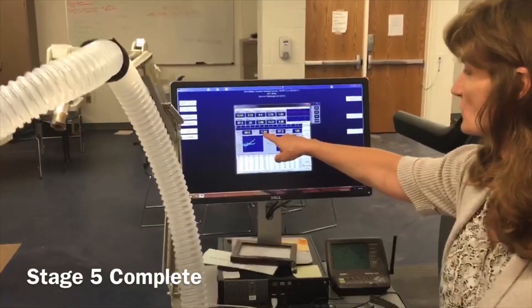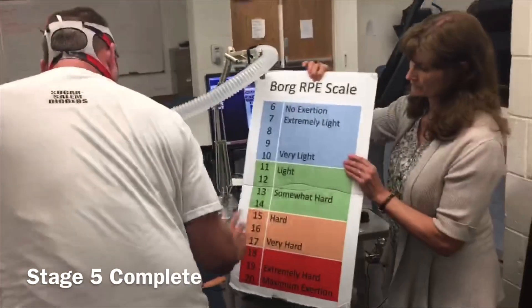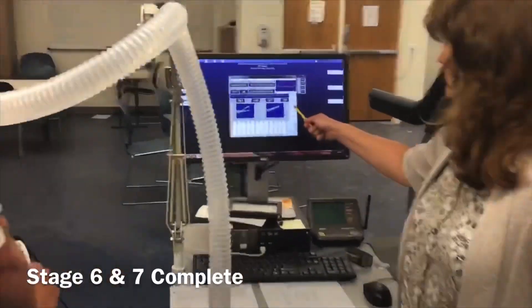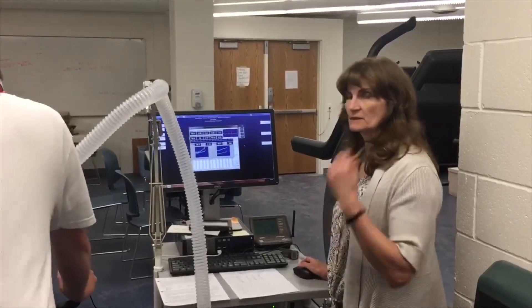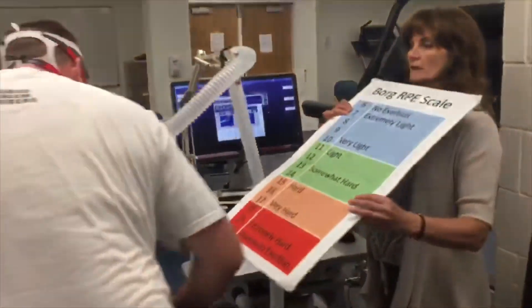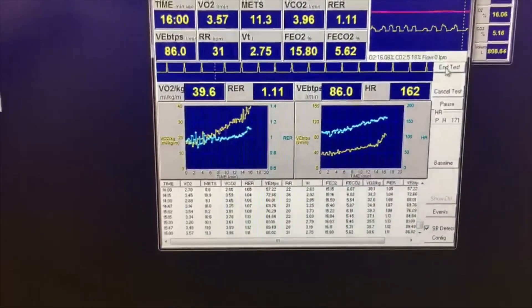Now our RER is up to 1.03, and heart rate is about 154. The RPE value at this level is 15. The subject tells us he's about done if we can finish this level. They give us this sign because they can't talk, meaning they're going to end the test. I'm going to take the last data at this level — his RPE is a 19 or 20. His RER is 1.1, so we're going to end the test.